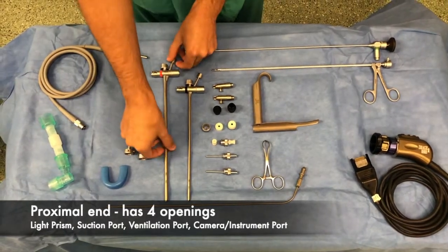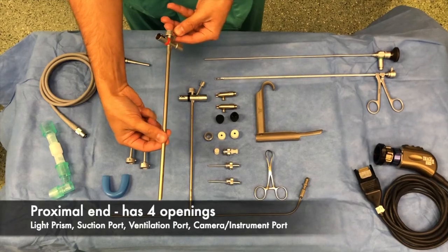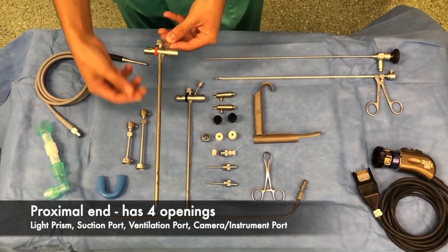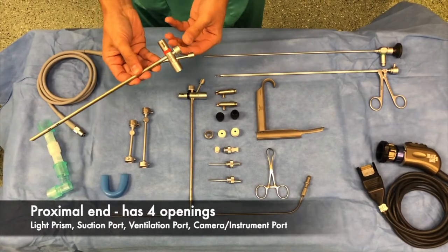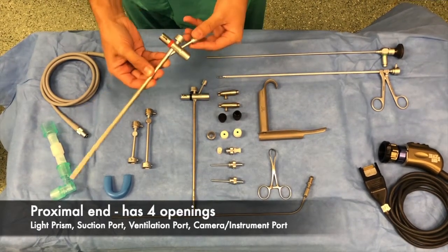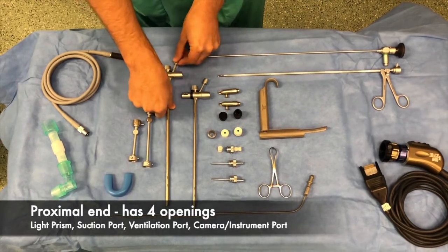The ventilating bronchoscope has four openings at its proximal end. These are for the light lead to be attached, for the insertion of instruments and the telescope, for suction, and finally for ventilation tubing.